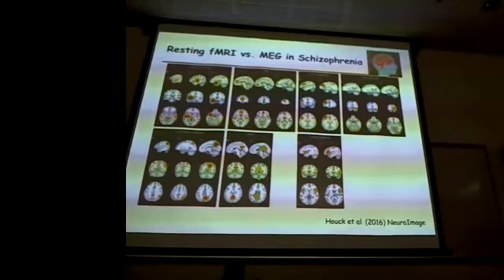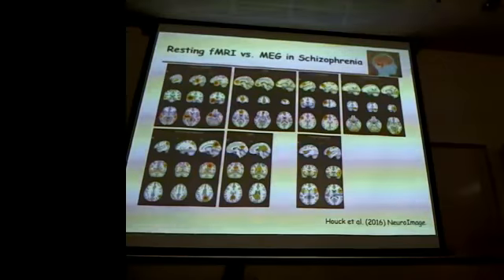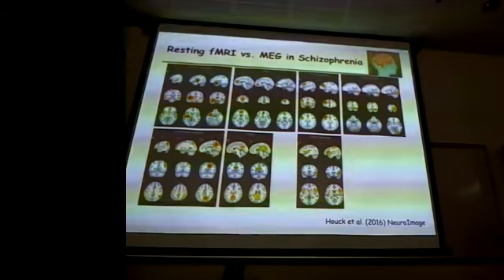But right now, the dynamic range for the optically pumped magnetometers is limited. It can't even cover 0 to 100 hertz with a sufficiently low noise floor, so you wouldn't get what you currently get with the current MEG systems. You have a much more limited field of view.